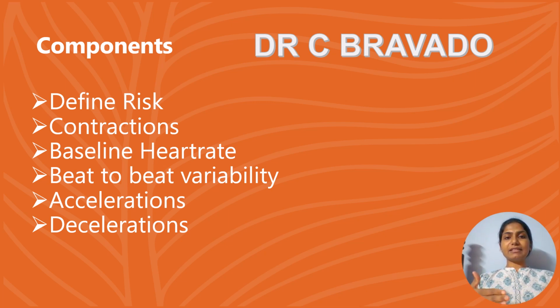But if the pregnancy is complicated with maternal risk factors, fetal risk factors or placental risk factors, then we can determine the fetal well-being with antenatal assessment. So we have to define the risk, whether it is low risk or whether there are any high risk factors. For example, if she is a case of preeclampsia, gestational diabetes mellitus or fetal growth restriction, CTG is very important.